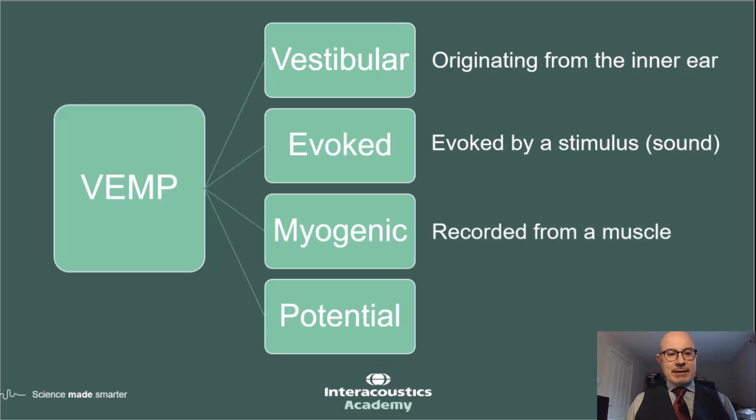They're myogenic. So in the world of audiology, that's a bit of a sidestep to what we're normally used to measuring. These are recorded directly from the muscle. So a little bit different to an auditory potential, although we are measuring them on evoked potential systems that we typically use for auditory potentials. So they do behave a little bit differently, and today we're going to take some moments to discuss that in more detail in relation to both the cervical and the ocular VEMP.